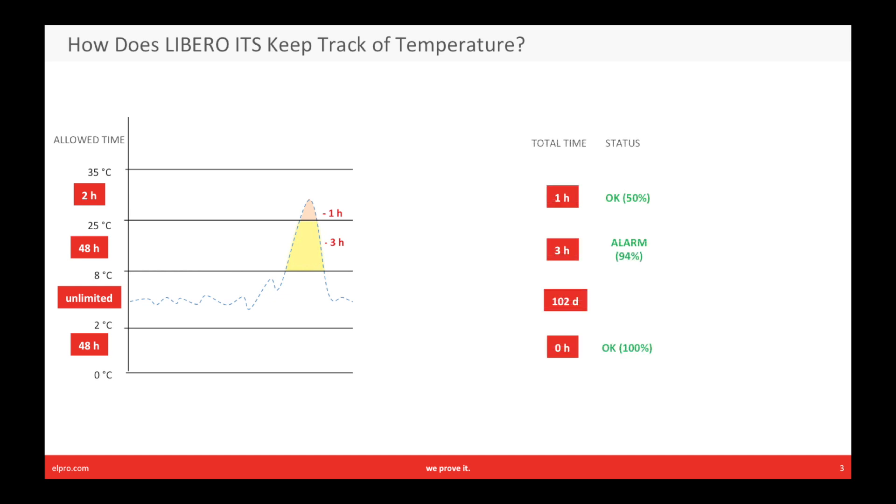The total time is now accumulated. The alarm status calculates how much of the initial stability is used up in each zone. Here, between eight and 25 degrees, we have used three hours from the allowed budget of 48, so 94% is left. And here, from 25 to 35 degrees, we have used one hour from the allowed budget of two, so only 50% is left.